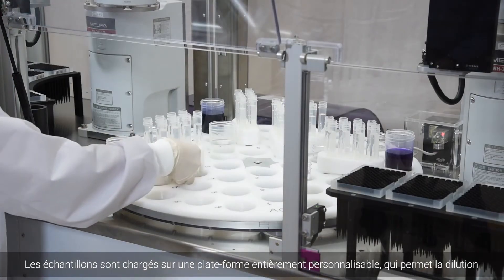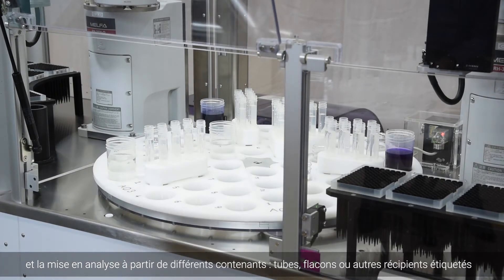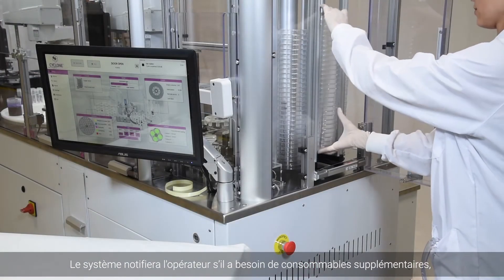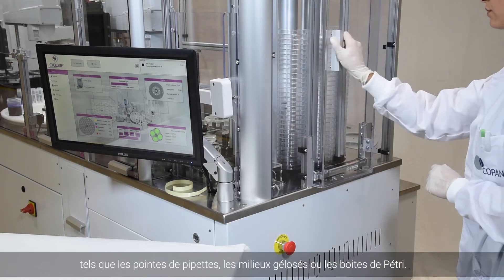Samples are loaded onto a fully customizable sample loading turntable that allows for the dilution and processing of any bottom-labeled tube, cup or rigid container. The system will notify the operator if additional consumables such as conductive tips, agar or empty plates are needed.